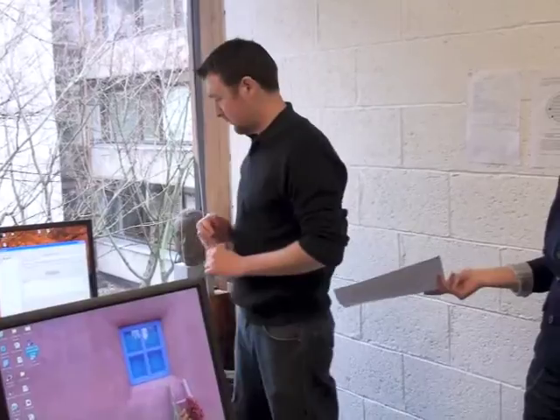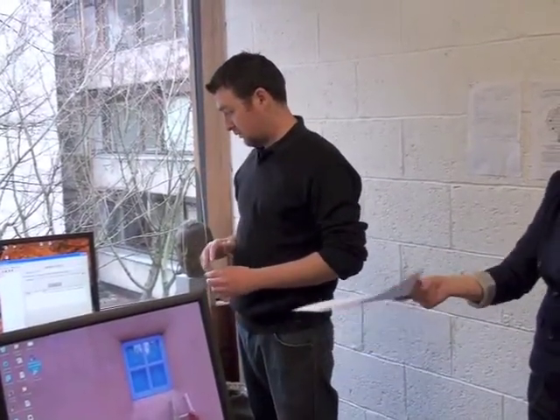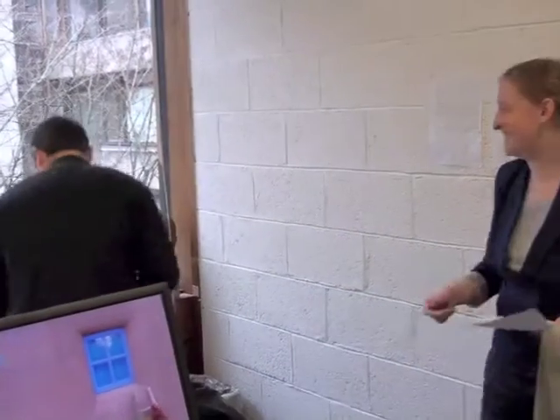And software-wise, it's compatible? I haven't used the software. I'm not sure. I just know Presentation is fantastic with it, and I would ask the manufacturers of BioSemi whether it's okay to use slower. But that's a good question. Sorry, you're not my student.